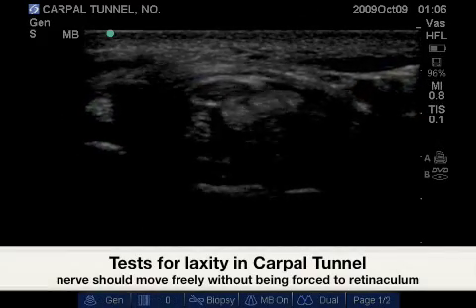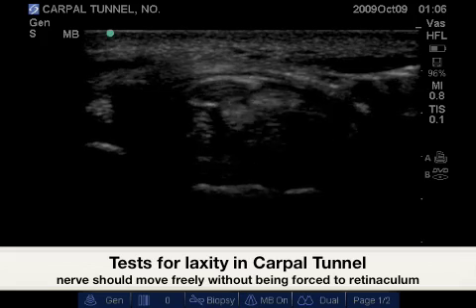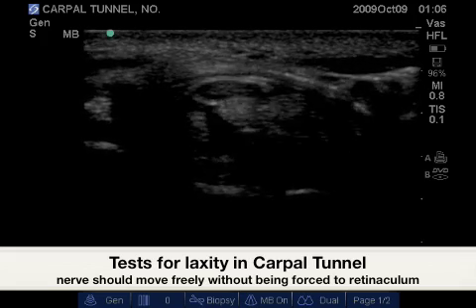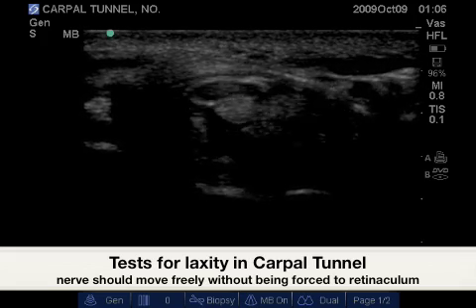It is also important to wiggle the fingers to test for laxity in the carpal tunnel.